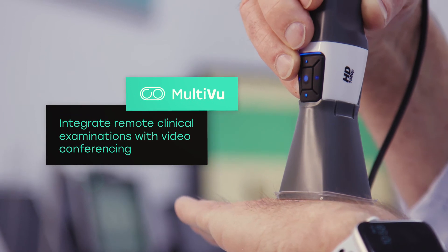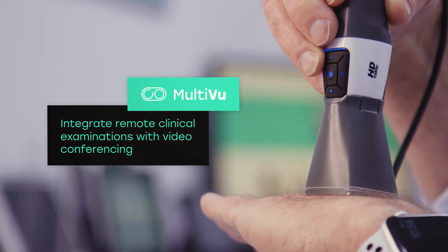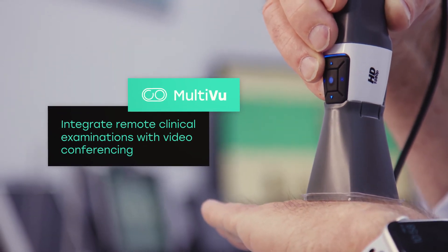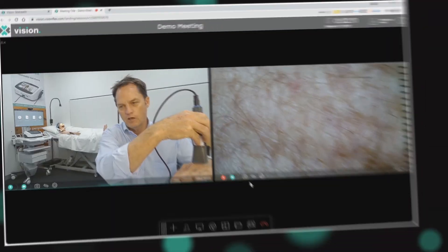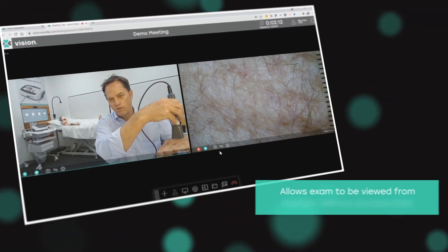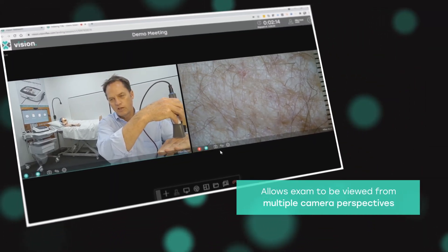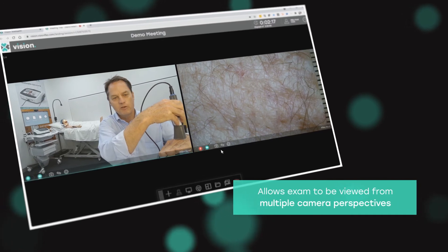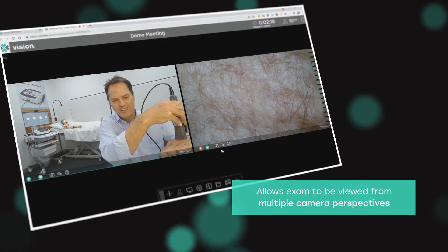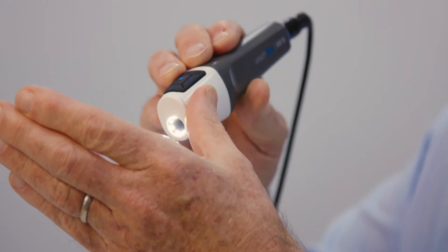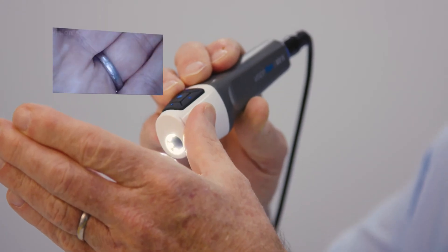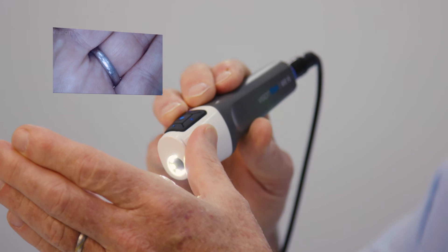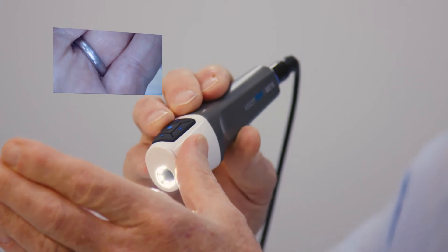MultiView allows us to bring multiple video sources into the call from any of the participants. This function gives the consulting physicians some context on what's going on in the room. They can see the doctor and the patient or the nurse and the patient interacting, but they can also see the clinical feed coming from the camera. This is a fantastic tool to better diagnose the patient and the condition.